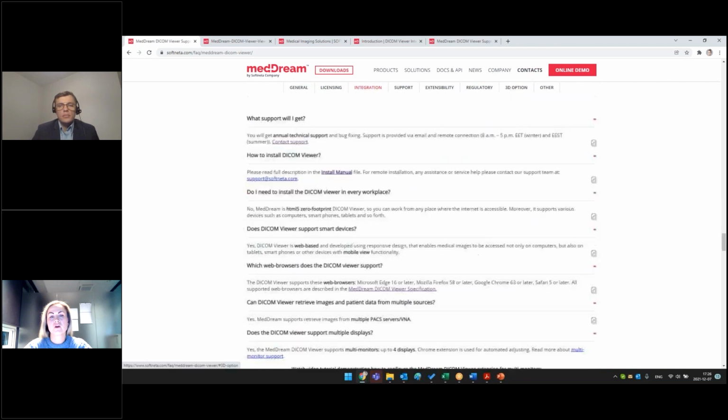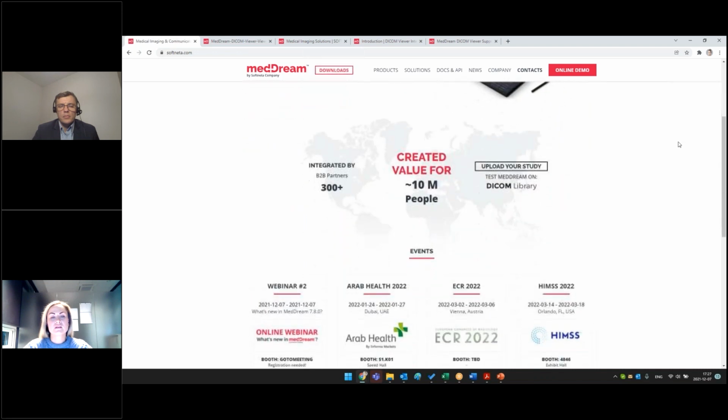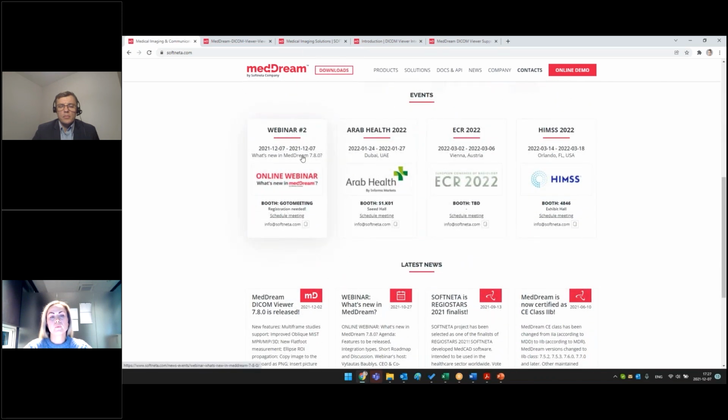For example, for the 3D option, we are going to prepare videos and put them here. And once again, make sure you get our newsletters, because all the news we put on our website, and we also send it by newsletter. For example, like this webinar, we put information on our social networks like LinkedIn or Facebook, but we put it here too, and you can easily find webinars. After the webinar, you can find the recording here. And when we arrange technical trainings, we're also going to put a note here, as an upcoming event.